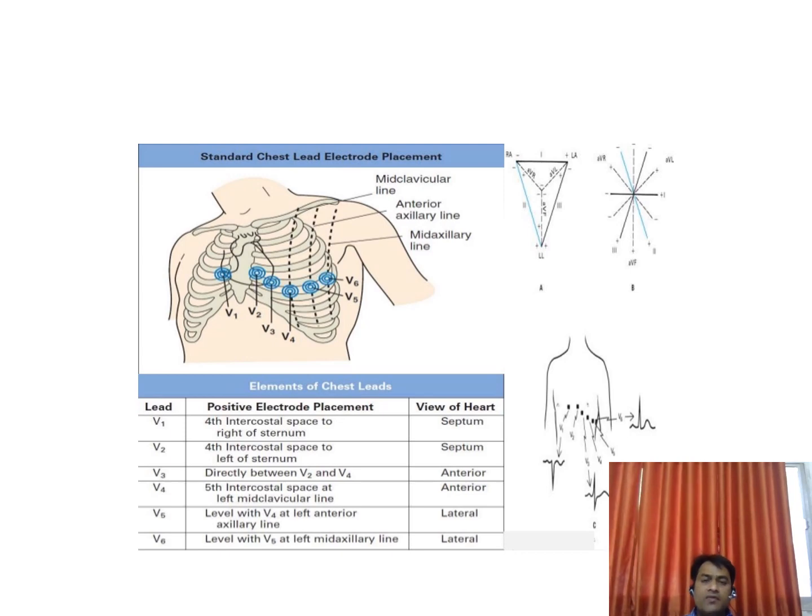this is how you can find out the intercostal space. First, place your finger over the sternal notch, palpate downward, and where you feel a bridge-like roughened surface, that is the sternal angle, or angle of Louis. That corresponds to the second intercostal space. Count the intercostal spaces, go down, and you can find the fourth intercostal space.